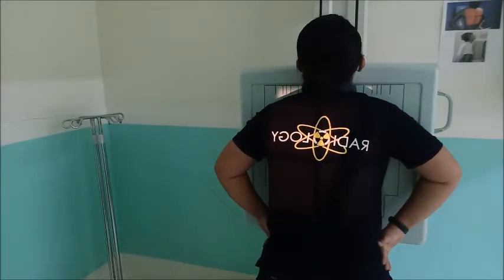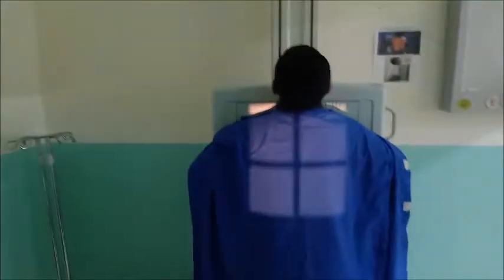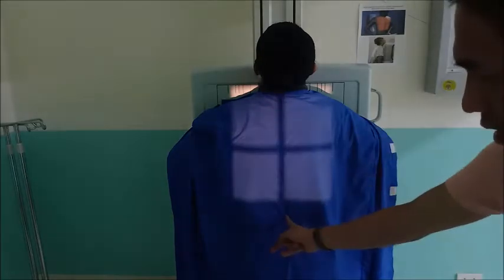Okay, so for the collimation, we have the crosshair at the center, the vertical and then the horizontal lines.